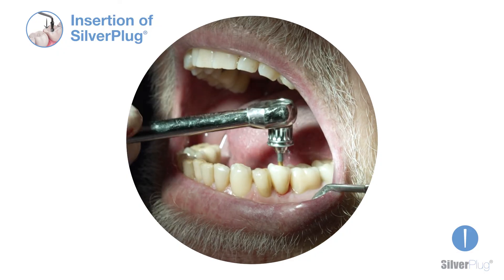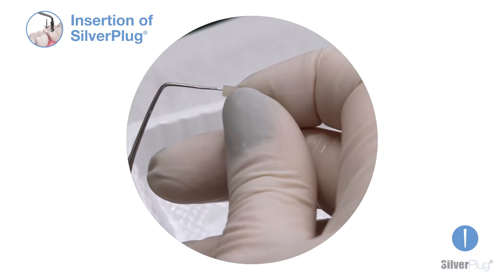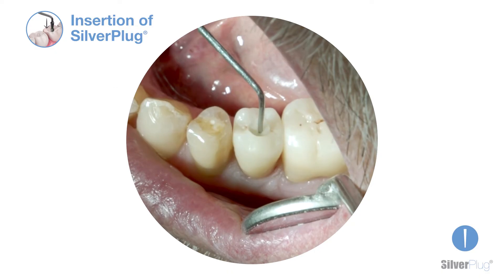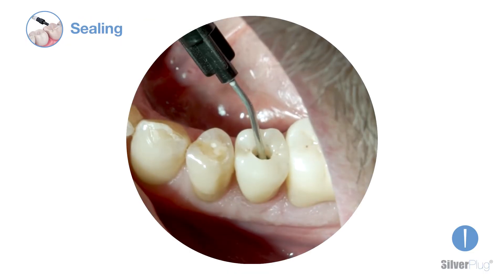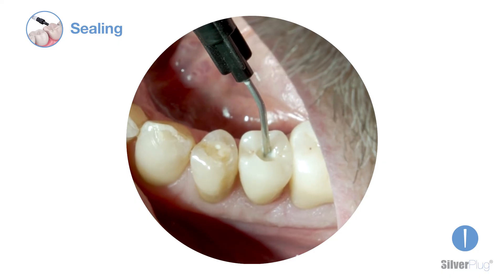Fit the implant prosthesis and torque the prosthetic screw appropriately. Pin the prepared Silverplug with a probe and easily insert it into the access canal with the help of a plugger. Finally, seal the access hole with a composite or fit the cemented crown following the usual procedures.